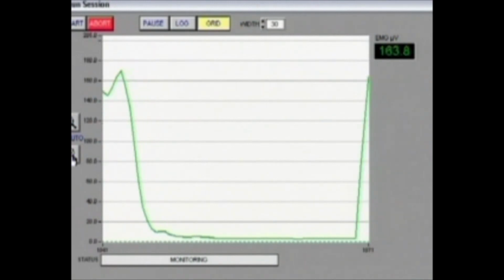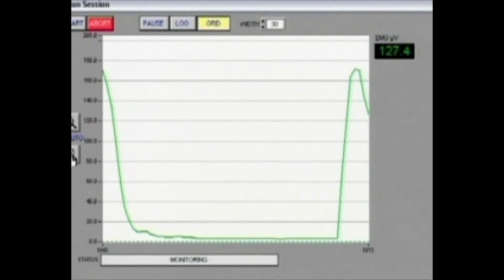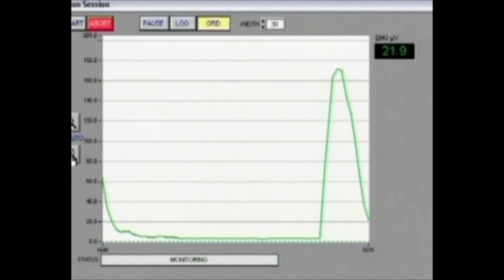And that's pretty high. People who brux, clench and grind can generally get up over 160. People who can't are often well below that, so that's certainly an indication that those muscles are developed and used to some exercise. So let's try it one more time. So just another clench, just as hard as you can go. And around 171, so that's pretty similar. So nice and relaxed with the jaw, because we don't want your muscles getting too tired for the demo.